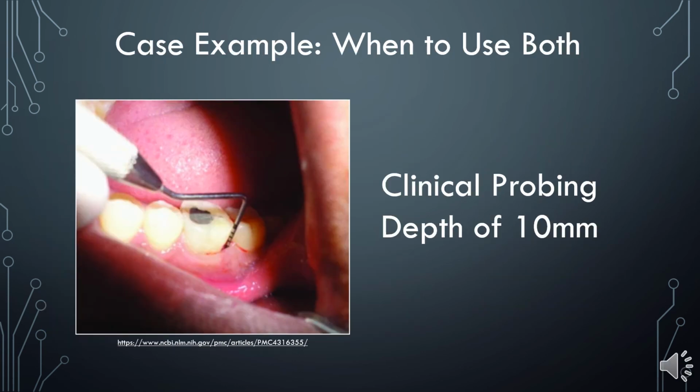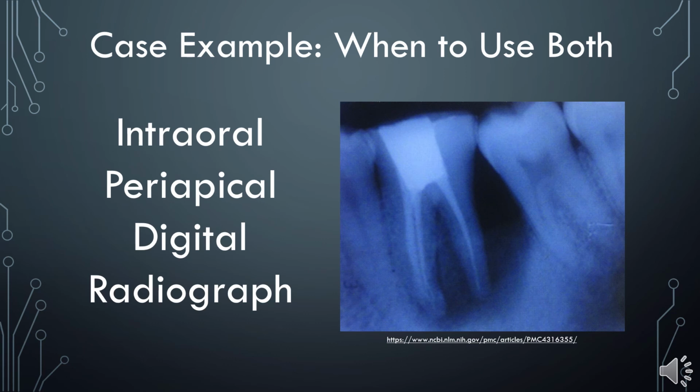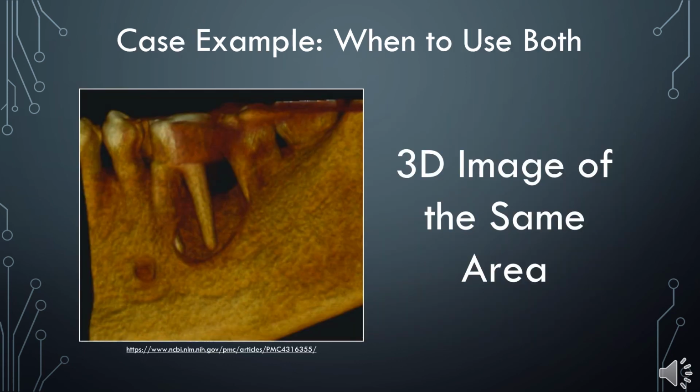As you can see, here is a client with a probing depth of 10 millimeters. Digital radiographs were used to detect bone loss. Further 3D imaging was used in the same area to gather more information for an accurate diagnosis.